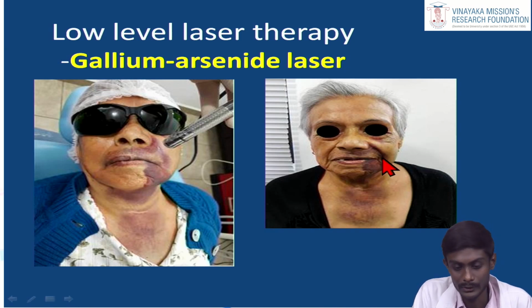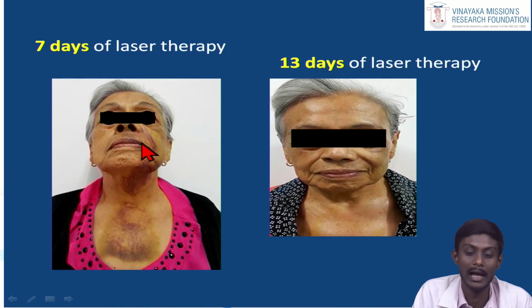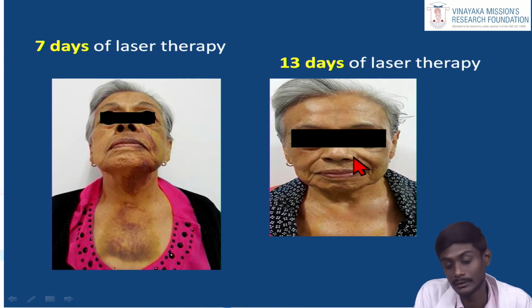This is the patient after the 3rd day: there is a significant reduction in the inflammation and bruising reactions, and the necrosis has also decreased. After 7 days of laser therapy, there is a significant decrease in the symptoms the patient exhibited. After 13 days of laser therapy, there is a complete resolution of the symptoms the patient exhibited.